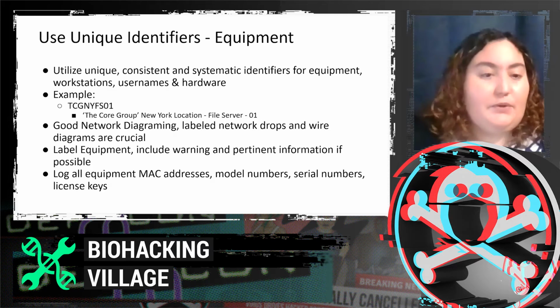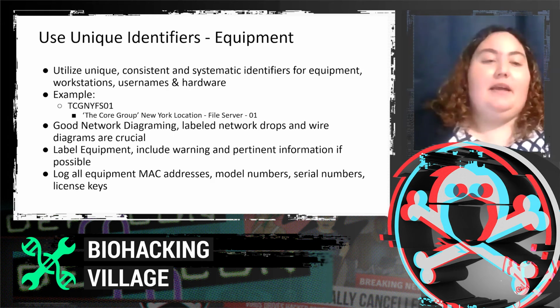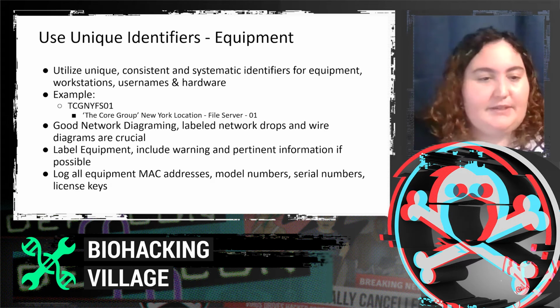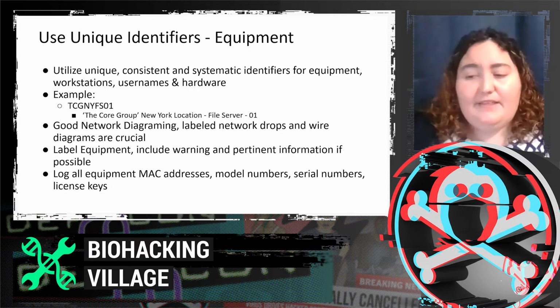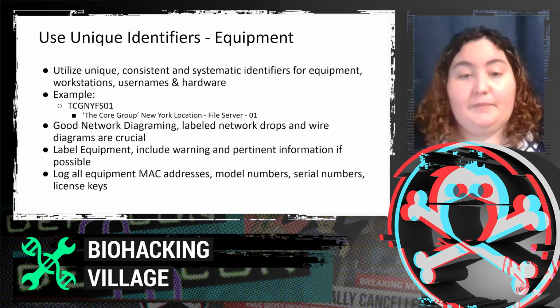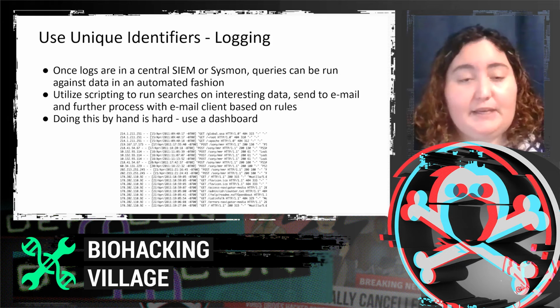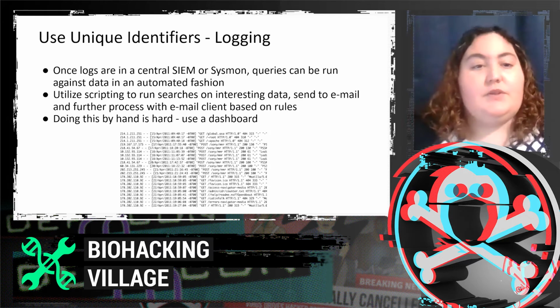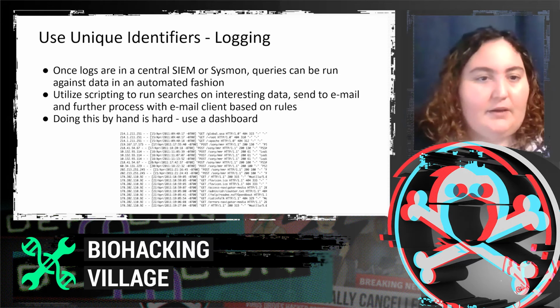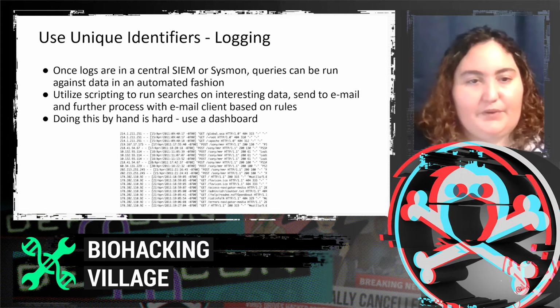You want to label your equipment, include warnings or pertinent information, and you want to also log MAC addresses, model numbers, serial numbers, licensing keys, anything that is important, especially if something goes wrong. So you use those unique identifiers when logging so that you can easily identify in your dashboard what is going on. Utilize scripting to run searches on interesting data, send this to email, further process.